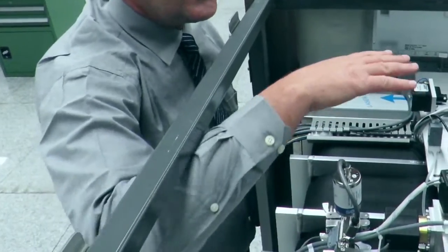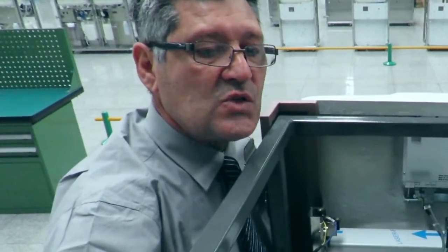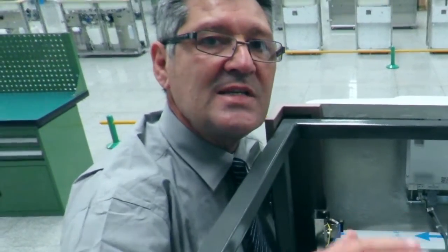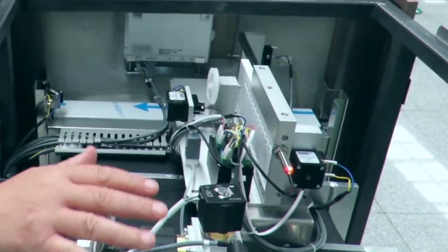So therefore there's no hands involved. It's completely safe to the environment, and that's why this technology is the safest technology for plasma sterilization in the world today.